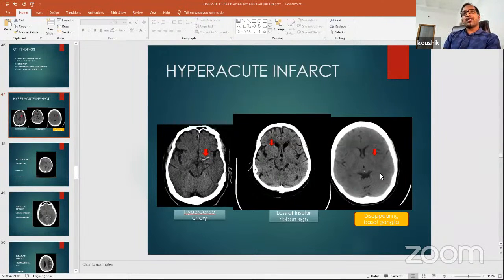The most common cause of headache is idiopathic, and the second is sinusitis. In migraine, we find no signs on imaging. Slow space-occupying lesions can also cause some sort of headache. So in headaches, CT acts like a screening tool, but people don't routinely advise CT because it involves radiation. MRI has no radiation, so the patient can get it done. With CT, the involvement of radiation is the only issue.